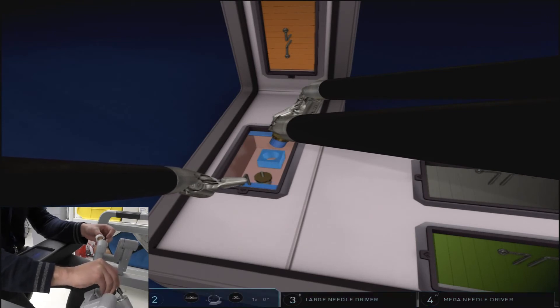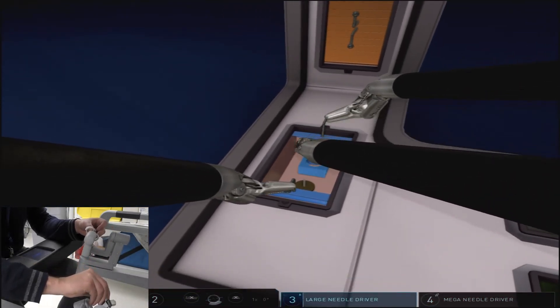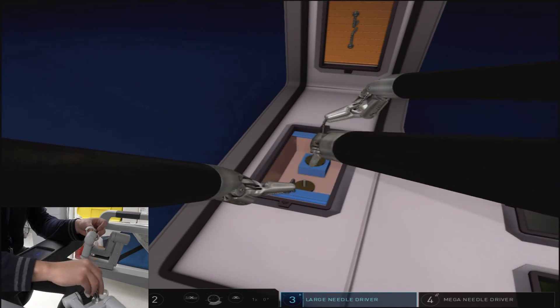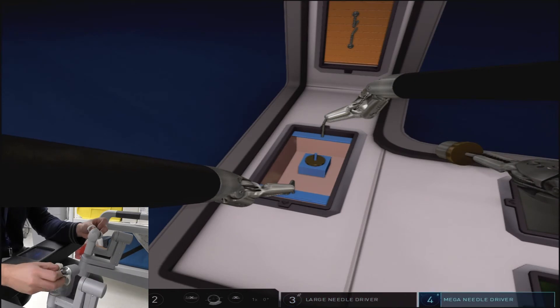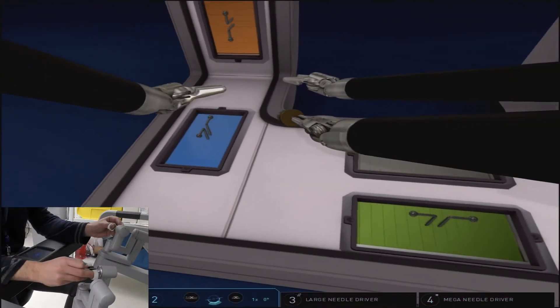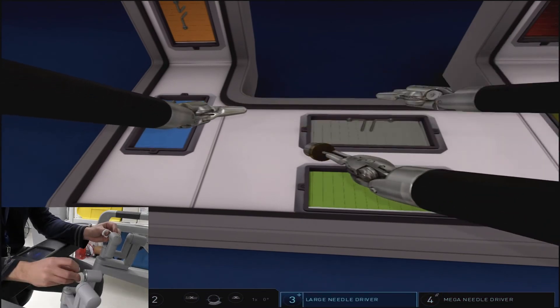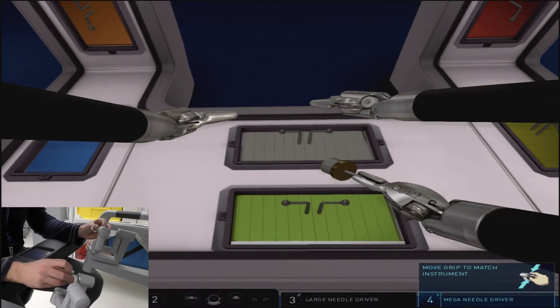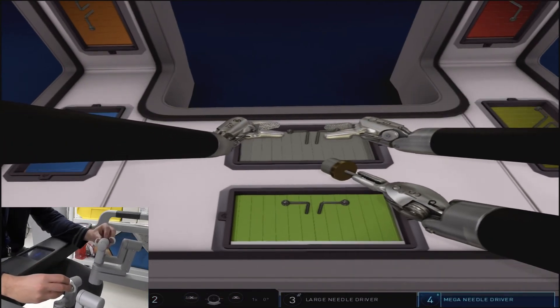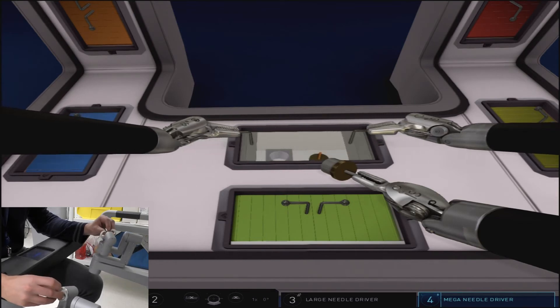As I'm placing this blue shape in its proper receptacle, I have a little bit of struggle with getting it in place, because I probably didn't grab it optimally from the other panel. Ideally, you want to grab the shapes in as vertical an orientation as possible and at the edge of the stem. This gives you the most distance and the best range of motion to place these in their proper receptacle without causing any issues.